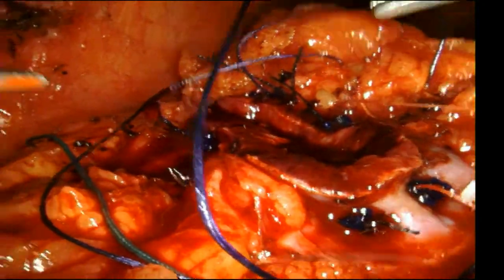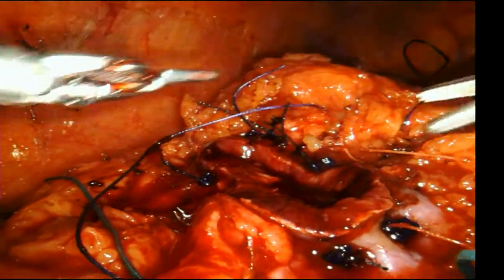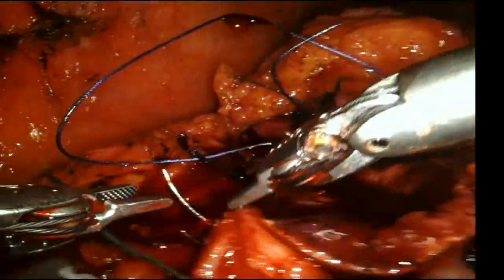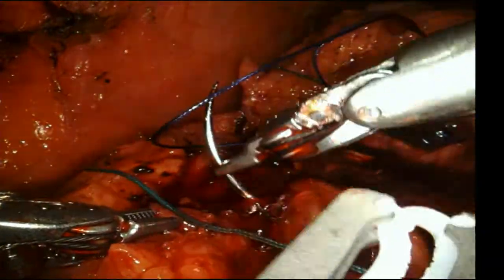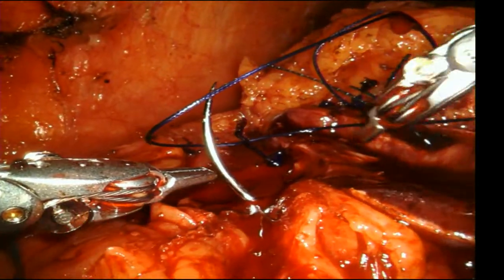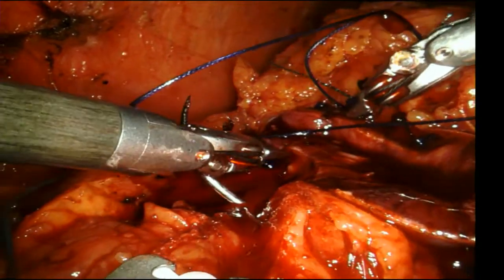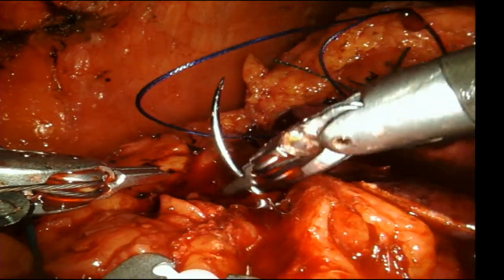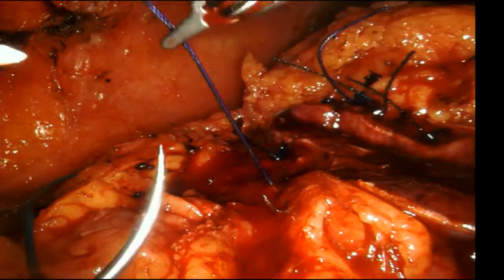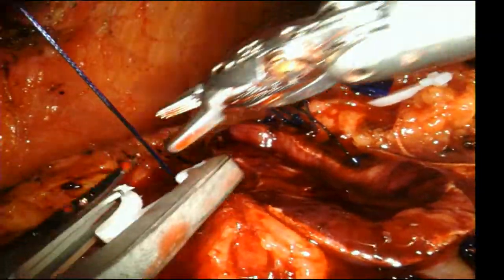So, things that people hate about this. The needle's huge. It's scary. I know. It is. You have to get used to it, but when you get used to it, you can get it exactly where you want it. The other thing people complain about is that you're killing all this kidney. I say, first of all, I'm going in the same depth as my initial layer, so this kidney's already dead anyway. And if I'm going to put the layer on the outside, I'm going to be squeezing these edges together anyway. So I don't think I'm really killing any more kidney. If I am, it's not functionally significant to the patient, at least not that I've ever seen clinically in any patient I've operated on.